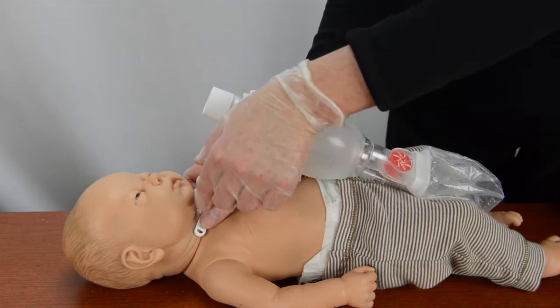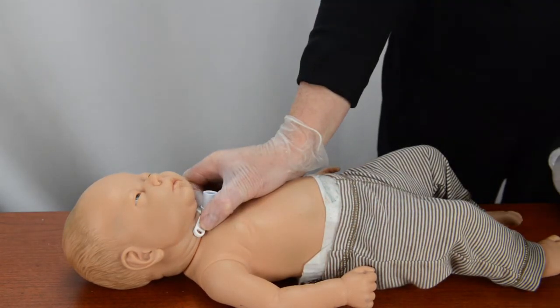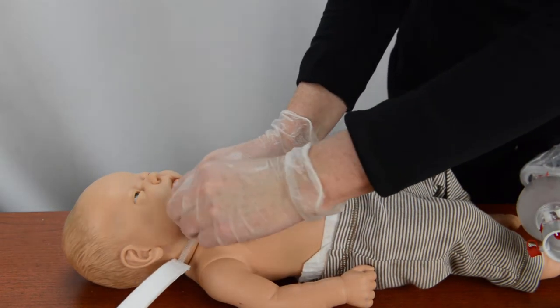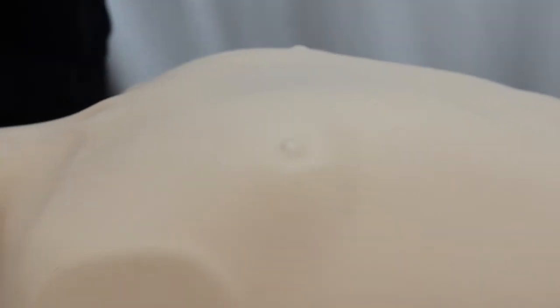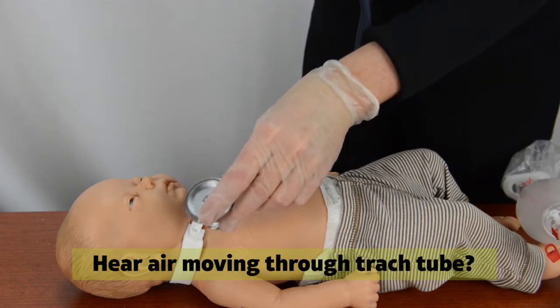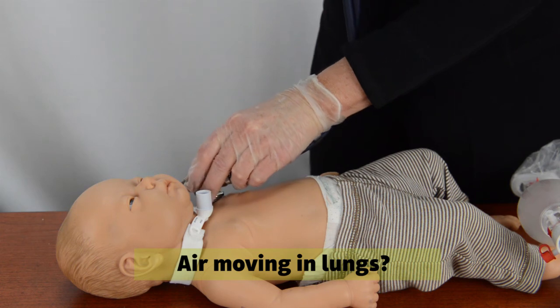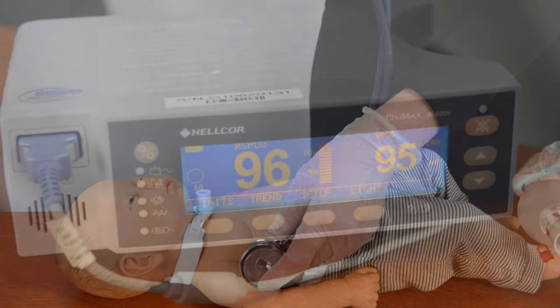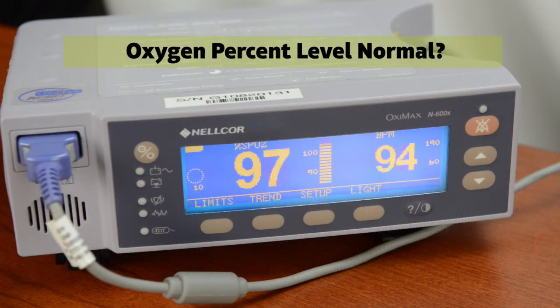If the chest rises, remove the resuscitation bag from the trach tube. Attach the trach ties to the new tube. Look again at the patient's breathing. Does the chest rise and fall with each breath? Can you hear air moving through the trach tube? Do you hear air moving in the lungs on both sides of the chest? Is the patient's skin color its normal color? If the patient has an oximeter, is the oxygen percent level normal? Contact the doctor or call 911 if the patient's breathing is not normal.